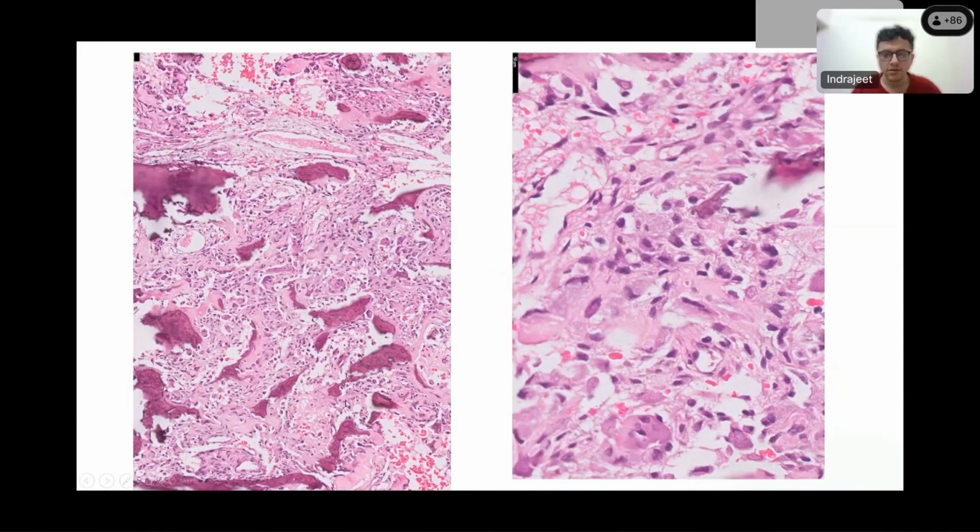So this is a primary osteoid producing bone tumor. Now the issue is cell type. And of course, I am seeing cells which are osteoblastic. Yes, very similar to what you saw in the first case.